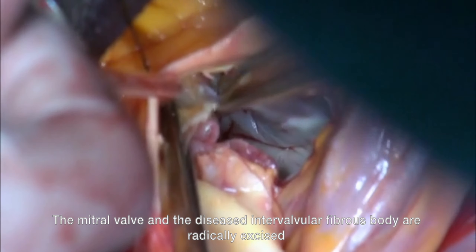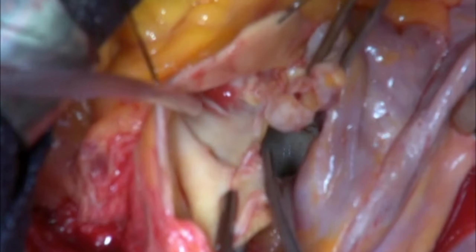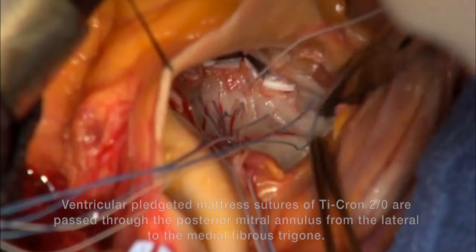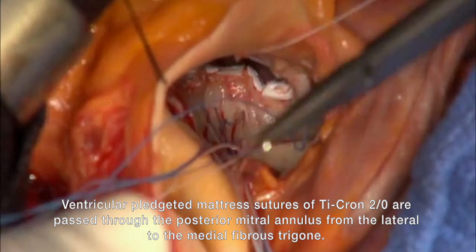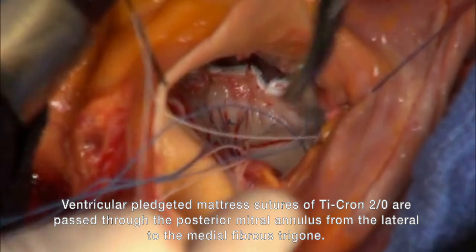In patients who underwent left-sided aortic and mitral valve replacement to prevent prosthesis-patient mismatch, the intervalvular fibrous body was simply divided.